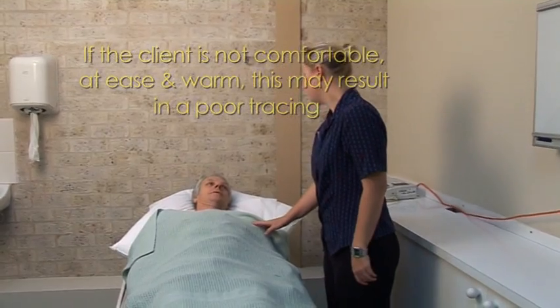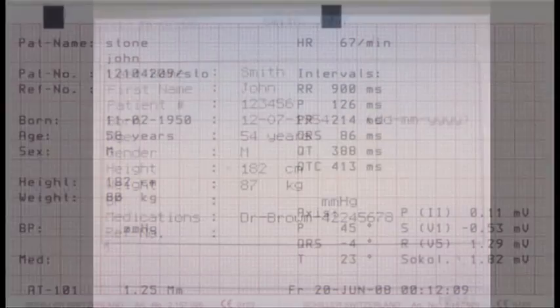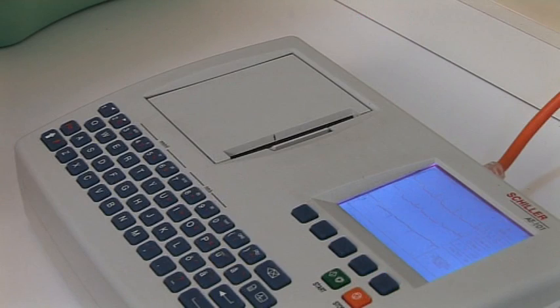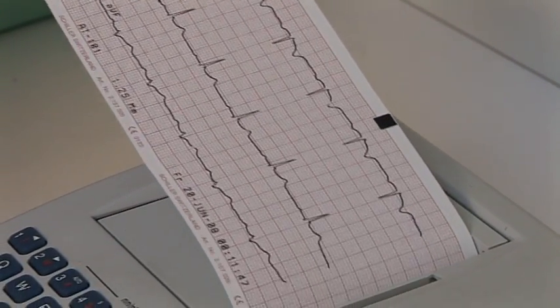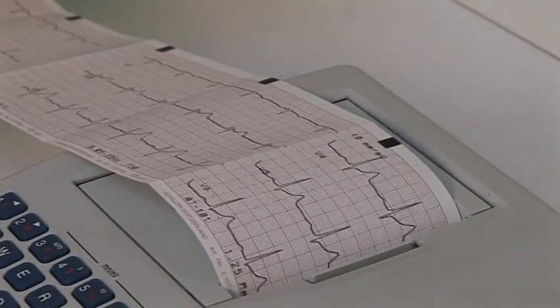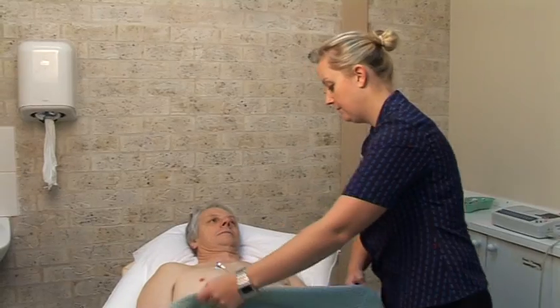Are you comfortable and warm? Yes, thanks. I'm just going to remove the leads now.